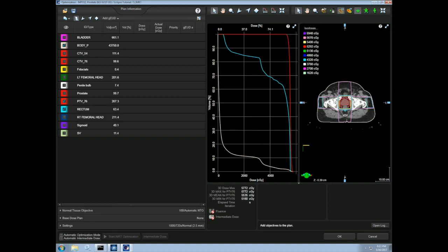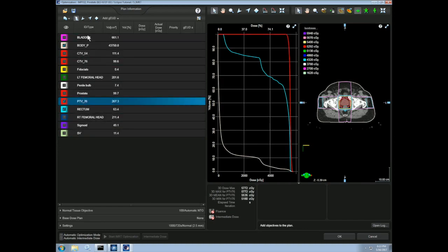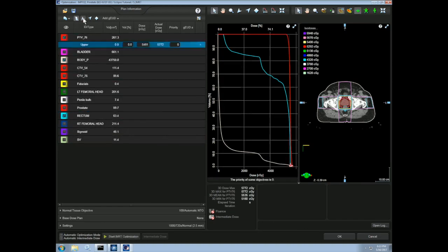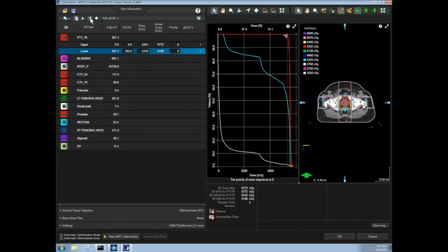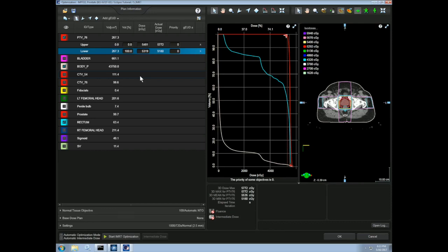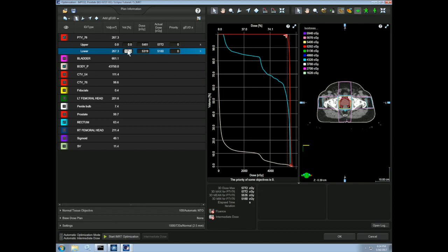So now that you understand what our optimization algorithm is actually doing, let's add some constraints. Let's start with the PTV. As I mentioned, we will have both upper and lower objectives on the PTV. We would like the PTV to receive at least the prescription dose with a nearly homogenous dose distribution. The lower constraint helps us achieve the prescription dose and the upper constraint controls the hot spots, making for a more homogenous dose distribution. For a lower objective, we usually want 95% of the target to receive 100% of the prescription dose, which is 54 gray for our plan.